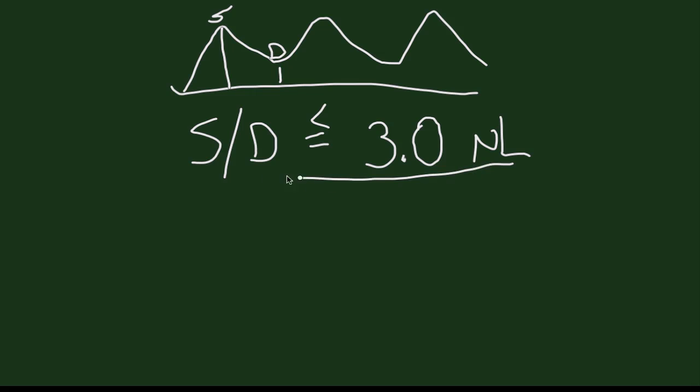However, if you're in a situation where you have absent end diastolic flow, then your diastolic number is going to be 0 and you will not get a result. The caveat to that is that if you have absent end diastolic flow, you are already aware of the fact that you have placental dysfunction, so these numbers aren't quite as important. You can just look at the waveform and tell that there's something wrong.